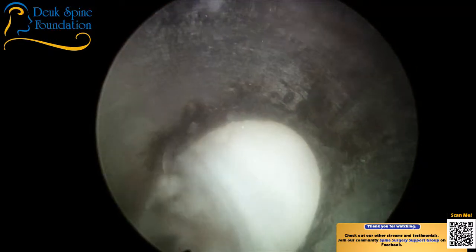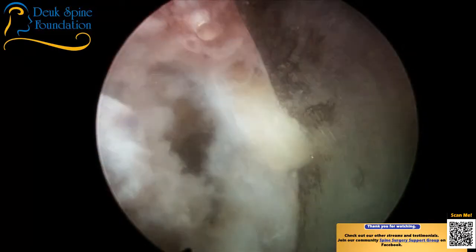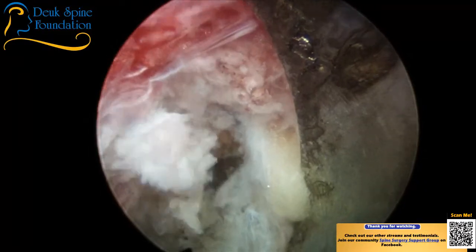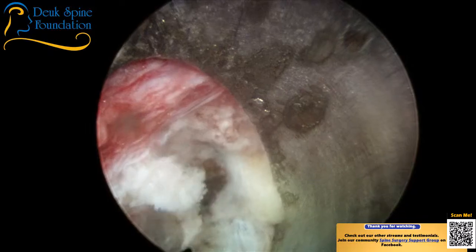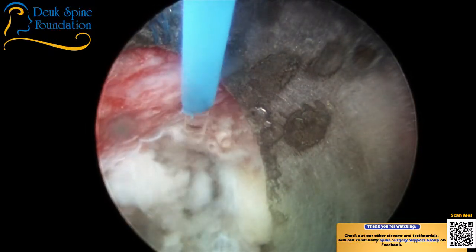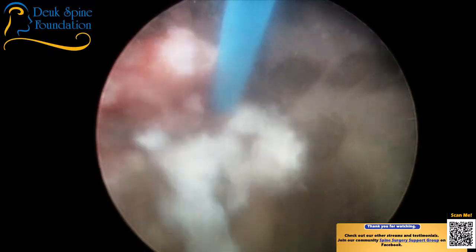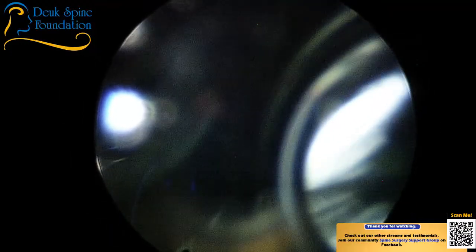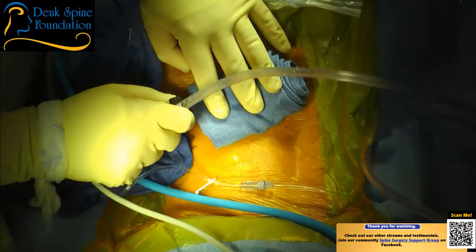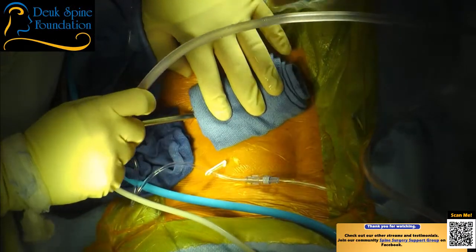All right, let's take a look at that nerve. See how close we are to the nerve? That's a nerve. Hey, there's the covering of the nerve. We're literally retracting it. And since we don't have any, okay, let me have the laser one more time real quick. 30 seconds. Done. All right. Scope off. I take care of that. I don't like the fact we can't do anything for the irritation that I'm causing with the surgery.